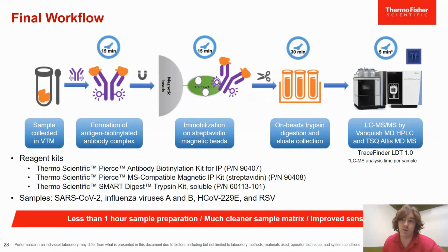The final workflow involved the same sample collection in viral transport media as previously shown for the other methods, with the addition of the antibody enrichment steps. Biotinylated antibodies for each target protein were incubated in the viral transport media, where they bound to the corresponding protein targets.